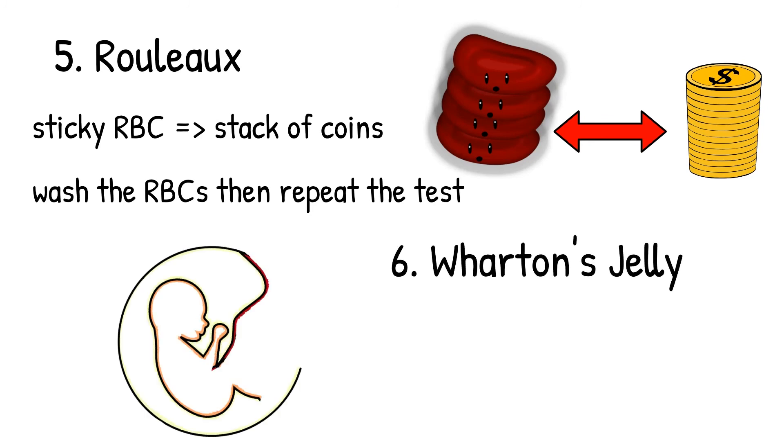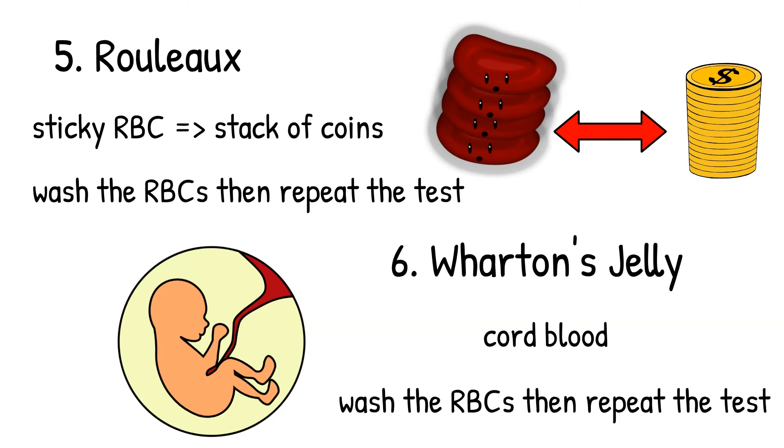Six, Wharton's jelly. Wharton's jelly comes from connective tissues and can be found in cord blood. So when we perform ABO typing using cord blood, we should wash the cell first to avoid interference from Wharton's jelly. Wharton's jelly cause false positive. Besides washing the red blood cells before performing the test, we can also request for a heel stick.